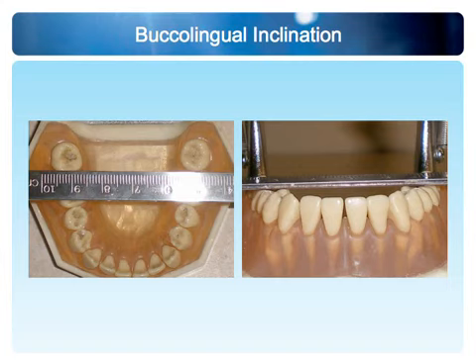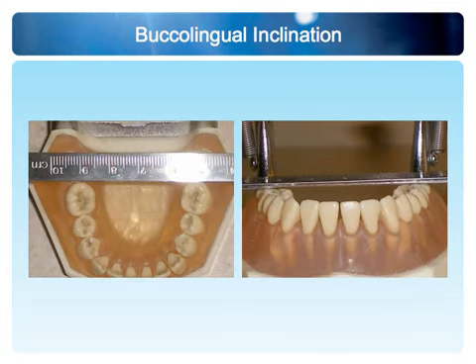So now we know, as a part of board certification in the orthodontic world, they like those cusps to be on top of that ruler, touching that ruler within a degree of 1 mm. So you have a leeway of 1 mm. Well, that's not a lot. It means that those posterior teeth should be upright. If we lay it across the second molar, the same thing. Lay it across the second molars and take a picture. We would see that all those cusps come within 1 mm.